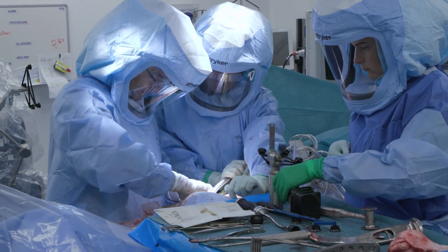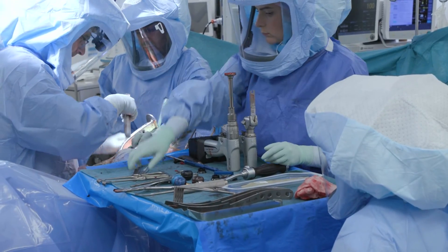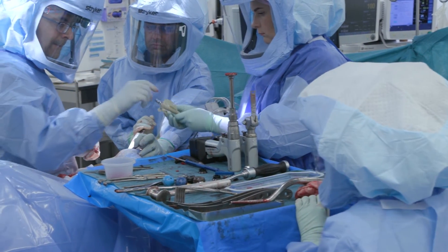Following this, the trial components are removed and the final definitive implants are impacted in place. The hip is then reduced and the wound is closed.